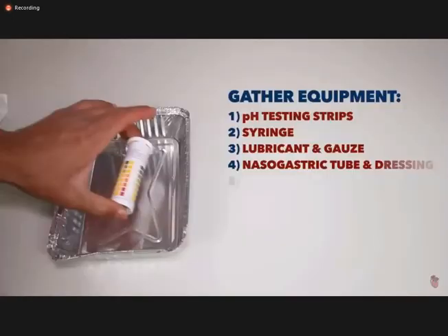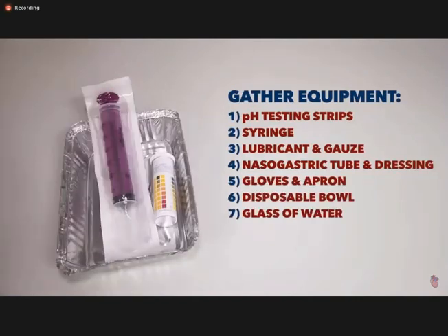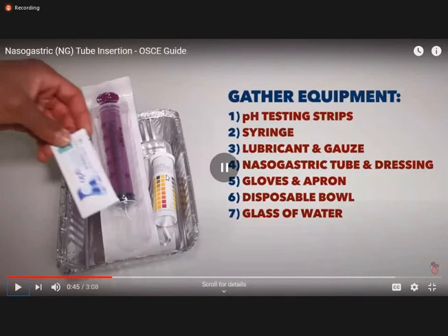And wash your hands and gather the equipment. Which equipment do you have? Testing strips, syringes, lubricant jelly and gauze, nasogastric tubes and dressing, gloves and aprons, a disposable bowl, and a glass of water with a straw.